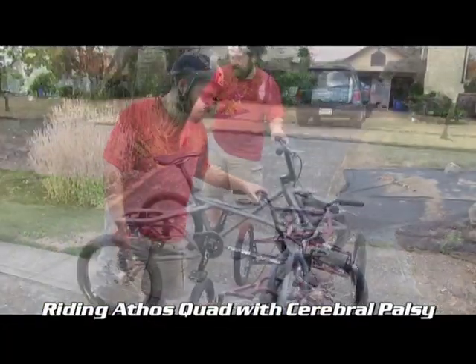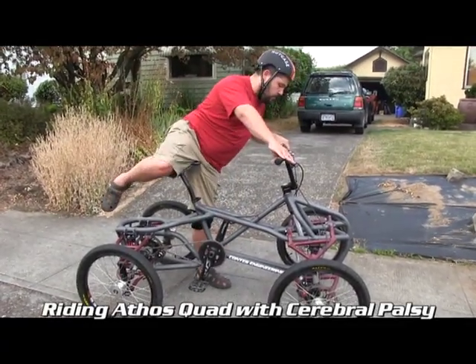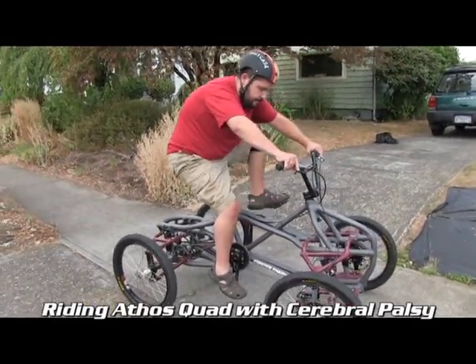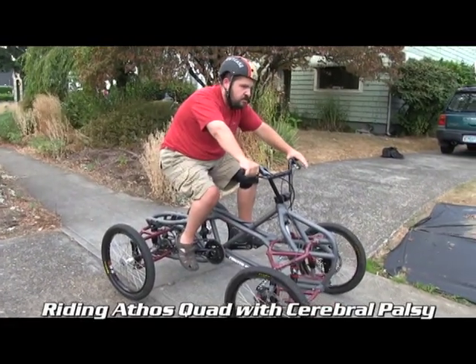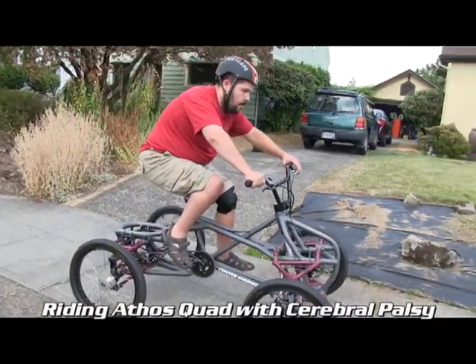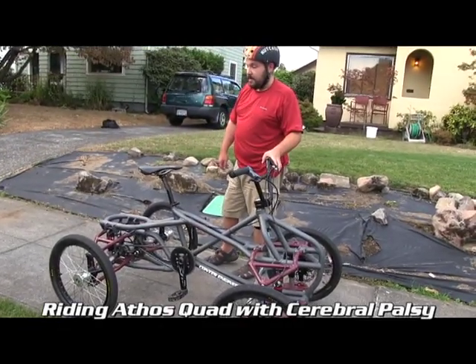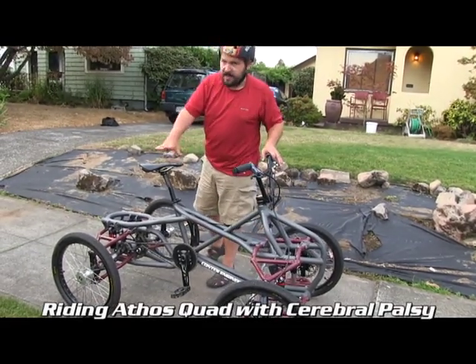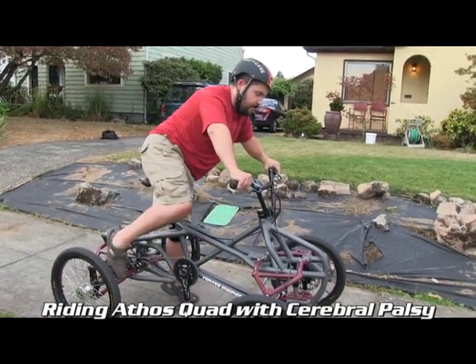Alrighty. This is just video of me mounting the bike. I hold one brake, the front. Some people would probably hold the back. And then I bring the pedals to a position that I can start going. And it's pretty easy to start. Yeah, that part's pretty comfortable. I have an easier time getting on this than I do the recumbent, without a doubt. It only takes a second.